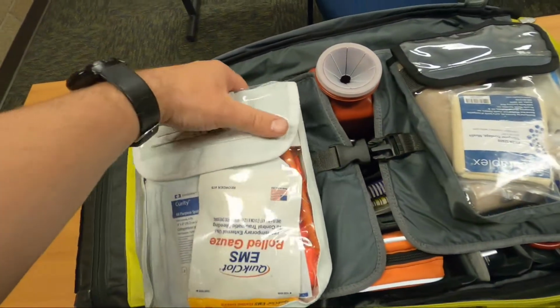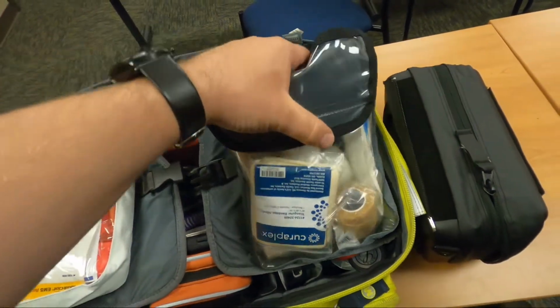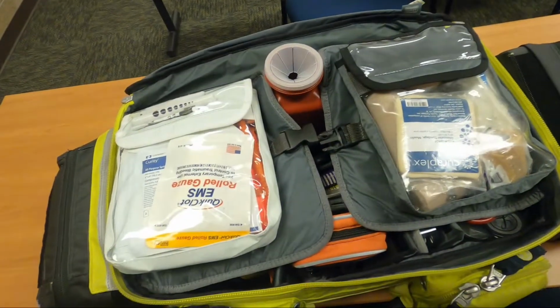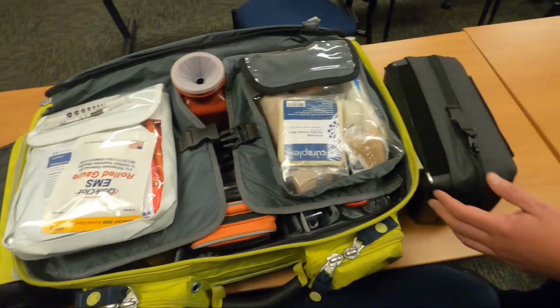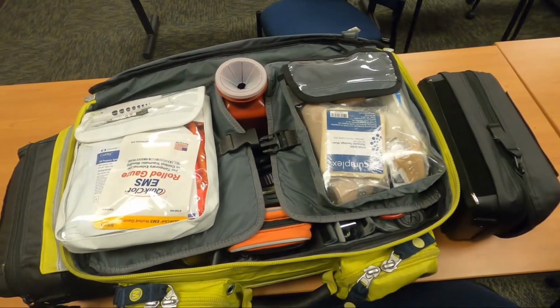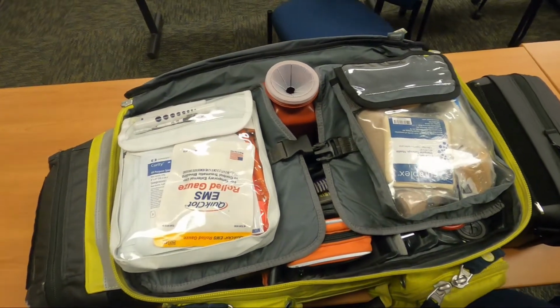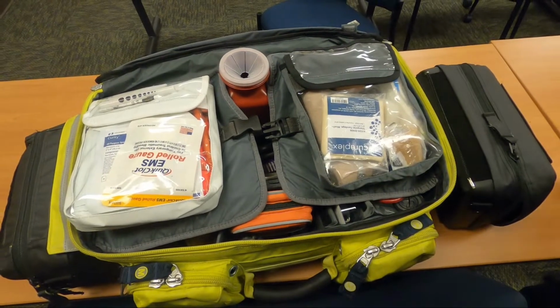So these are nice because they can just easily be removed in case we have multiple patients or tight access. They're easily removed and able to be used. Again, we're looking for feedback on this. If you have any changes to be made to either of these kits, please come to Dylan or I, and we'll try to see what we can do to make this the most efficient we can. The inventory sheets will also be updated accordingly as well for Thursdays.